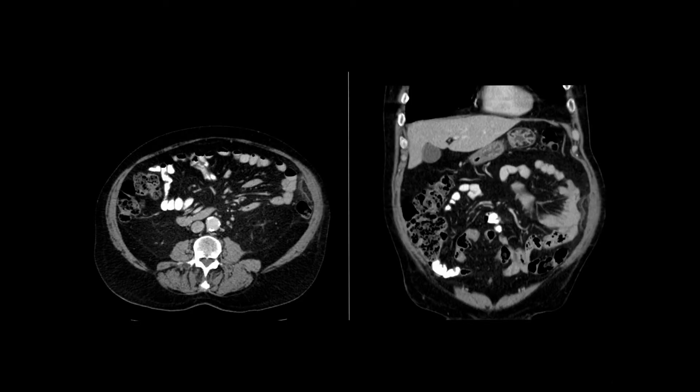This is a patient in her late 50s who presents with left-sided iliac fossa pain. You can see here adjacent to the descending colon there is an ovoid fat containing structure with some surrounding peritoneal fat inflammation.